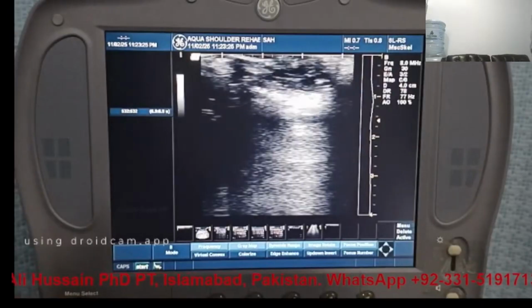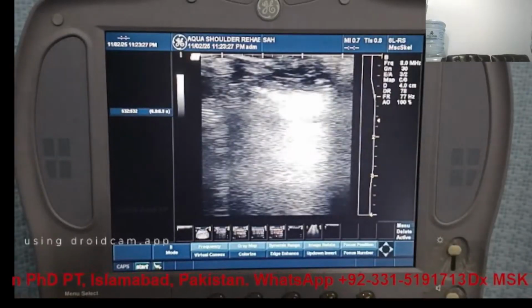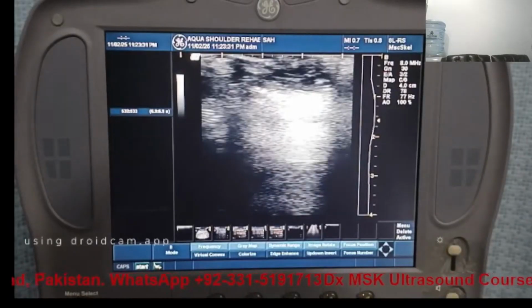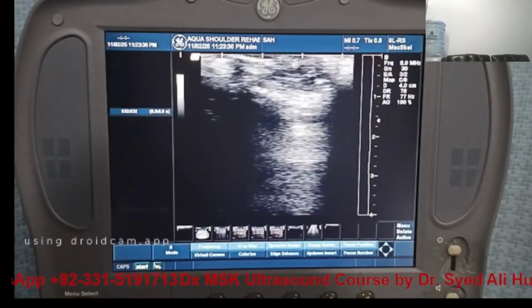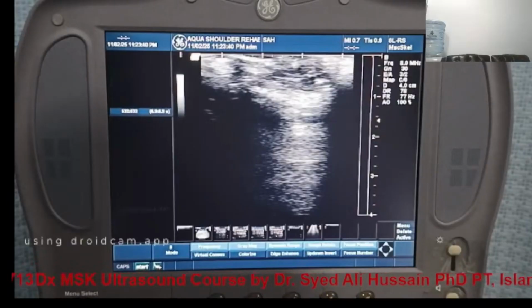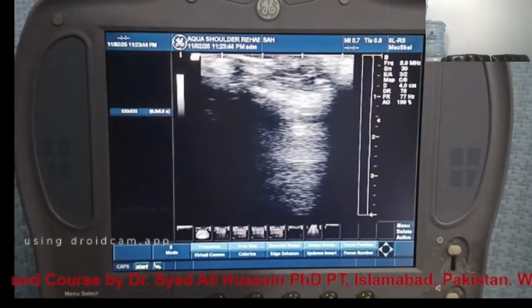So similarly, it has different regions, like 8 regions, and you can specifically fix a region. You can increase the output of the machine using this. So you can set it manually.